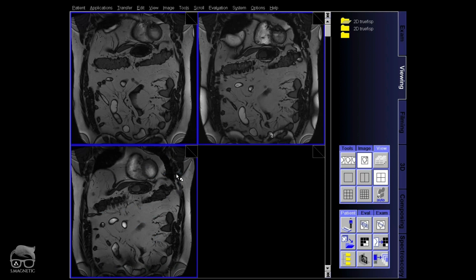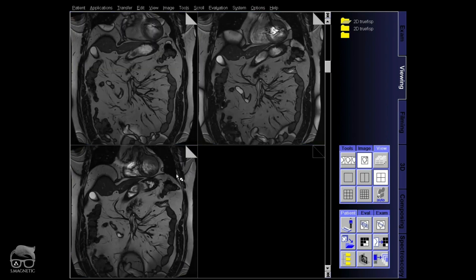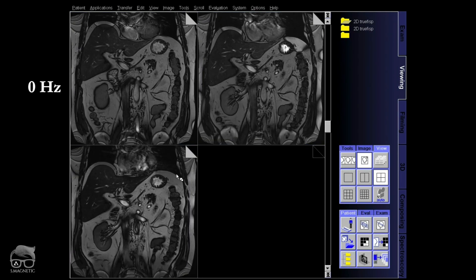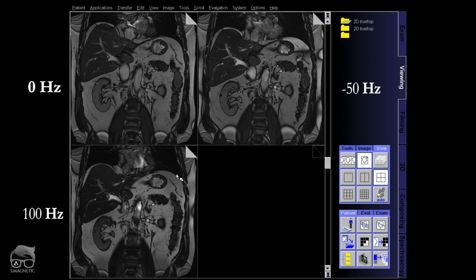The first one is frequency delta 0, then you have minus 50, and then 100. In this case, 100 Hz did work, as you can see there.